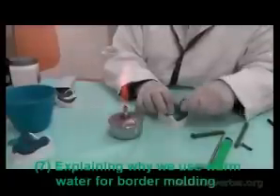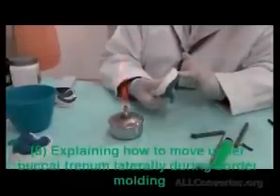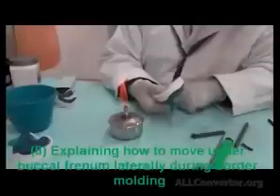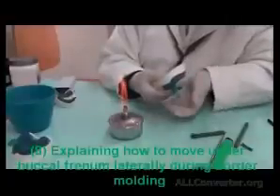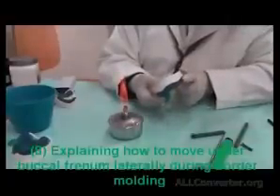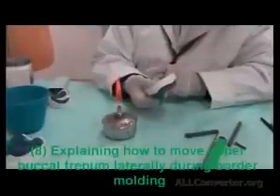I'll be taking the cheek downwards, pulling. For this upper, I'll be taking the cheek and pulling it down. And once I reach this distobuccal angle, it has a different border molding procedure where I ask the patient to open maximally and go with his mandible to the left and right. This will record the area with the coronoid process close by, which is very close in this situation. Take it out, check. I see the continuous border all around.